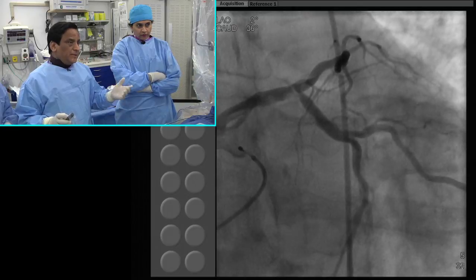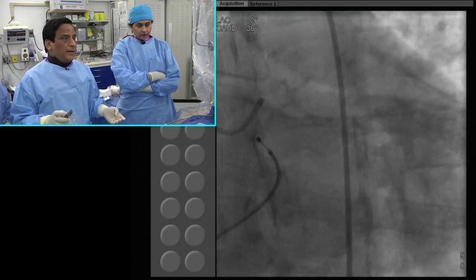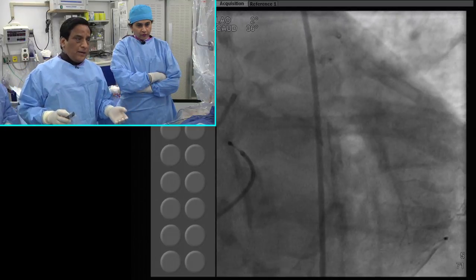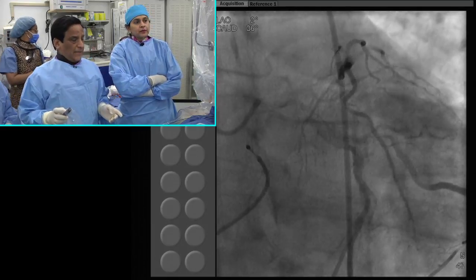Of course, this is the kind of case where you need to have a step burr approach. You cannot go to the big burr right away, but this is the case which will go up to 2.0 or a higher burr, which happens maybe in 5-7% of our rota. 7 French system? Yes. Excellent.